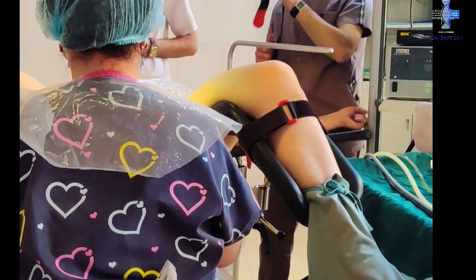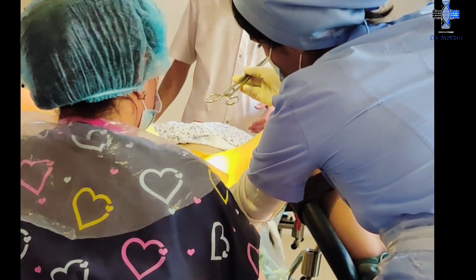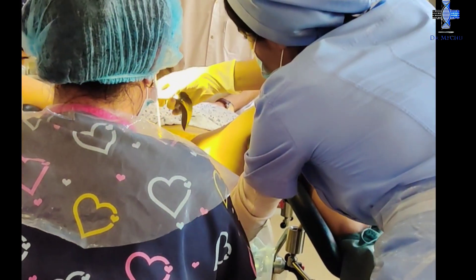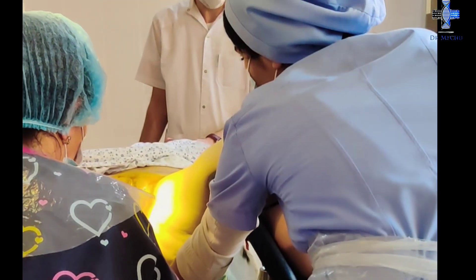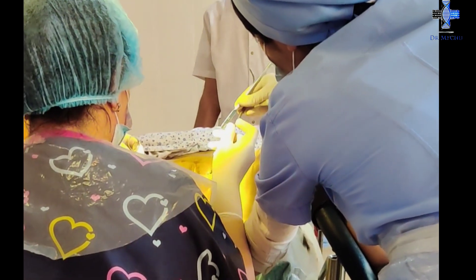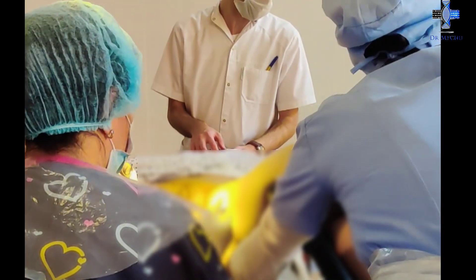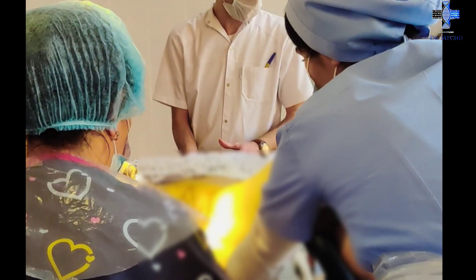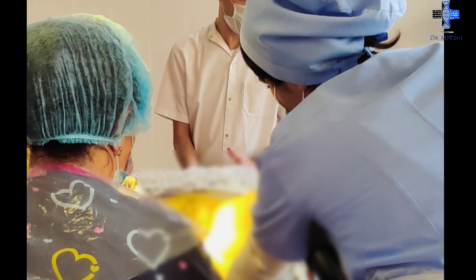Hysteroscopic intervention can also be done under general anesthesia — endotracheal or laryngeal mask — or monitored anesthesia care, as in this surgery we are seeing. Prophylactic antibiotics are not always necessary. The patient is in a lithotomy position during the procedure. The procedure starts with cervical dilation. The diameter of the modern hysteroscope is generally small enough to conveniently pass through the cervix directly, but for a proportion of women cervical dilation may need to be performed prior to insertion, using a series of dilators of increasing diameter, as we can see the nurse is continuously replacing the dilators.